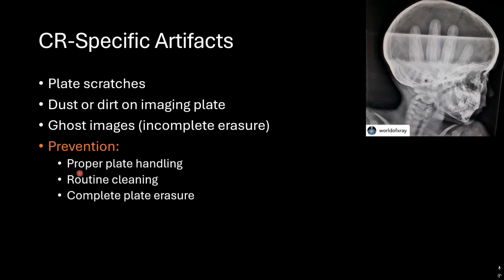So how to prevent that? First, proper plate handling, so no scratches or dust on the plate, routine cleaning, and complete plate erasure.